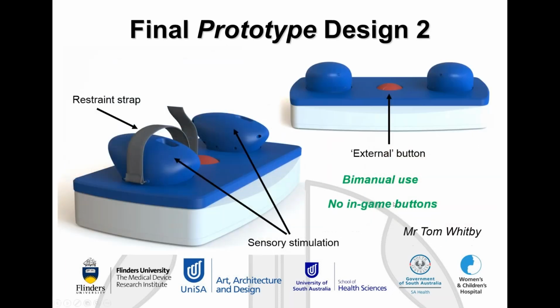The second student working with me came up with this controller. So you can see that this one here has morphed quite a bit from what the original design he had with the mice sort of sitting to the side of a green plate on top of a round base. It's the same idea. You use this blue base to move the controller forward and backwards, so forward, backward, left and right. And you can see it's all the same things that we were talking about before.